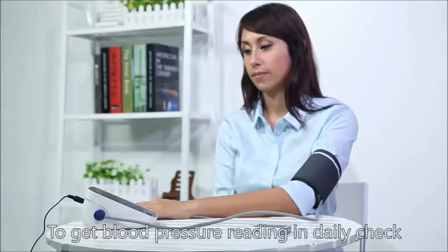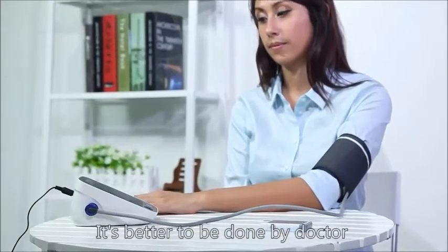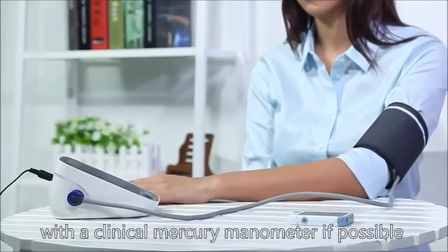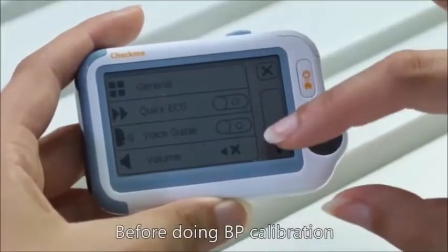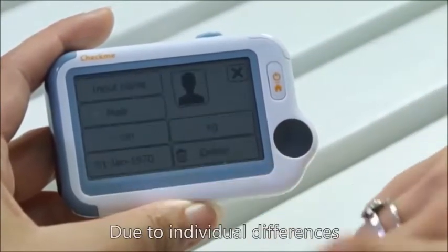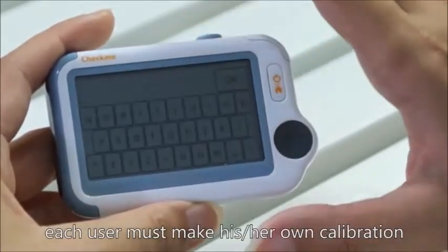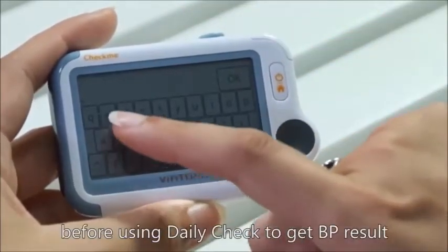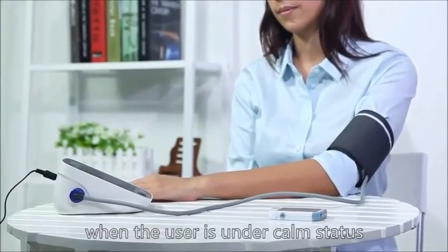To get blood pressure reading in daily check, the device should be calibrated with a cuff BP meter. It's better to be done by a doctor with a clinical mercury manometer if possible. Before doing BP calibration, you need to create a user account first. Due to individual differences, each user must make his or her own calibration before using Daily Check to get a BP result. The calibration should be performed when the user is under calm status.